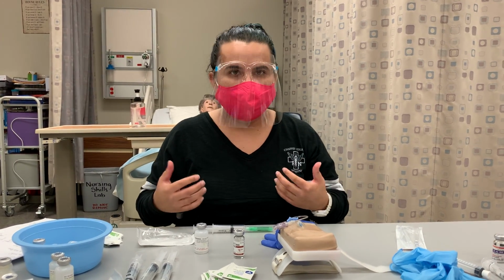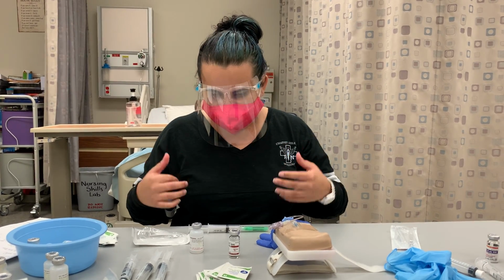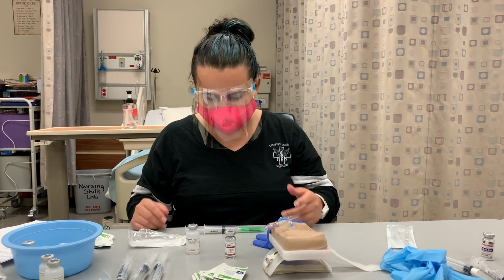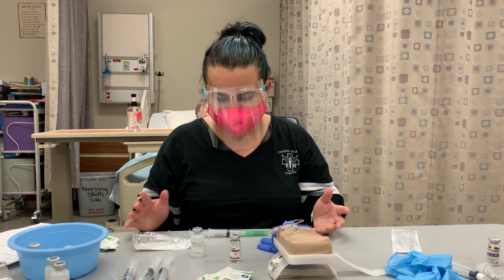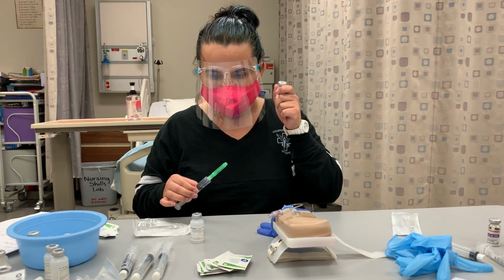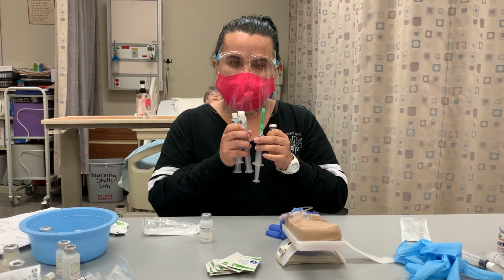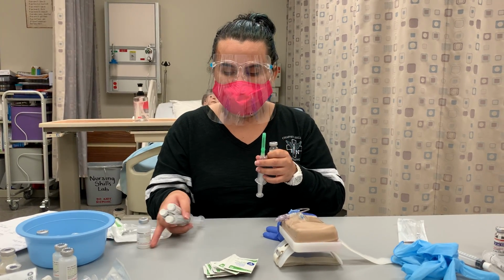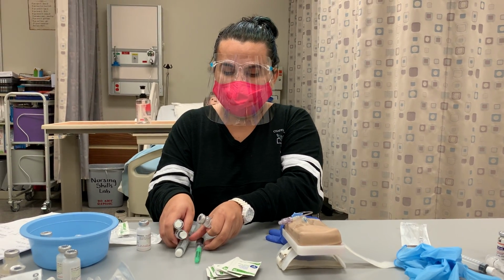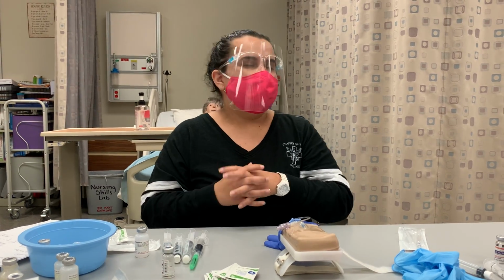And I will initial my name and the date, just to make sure that it's me, the one that prepared the medication. From here, I would grab my medication. I will take it to the room, to the patient, and I will take my 3 flushes along with my alcohol swabs. Once I enter the room, knock, knock, knock, hand hygiene.